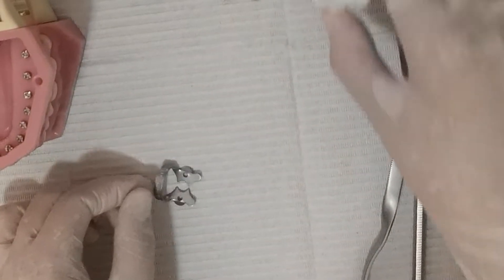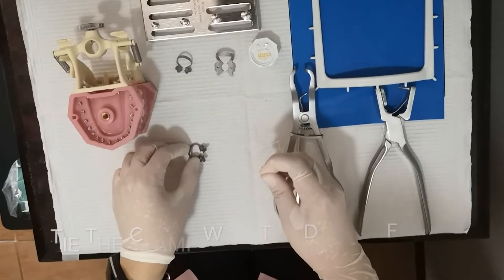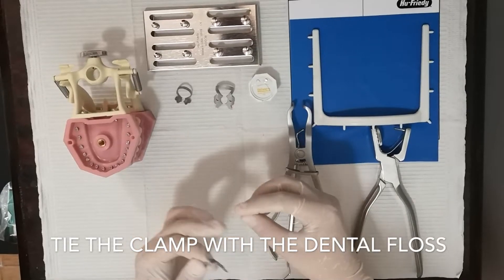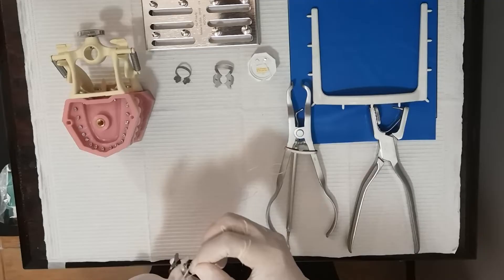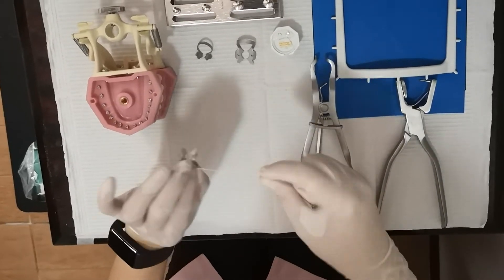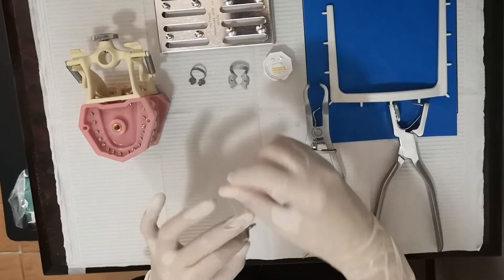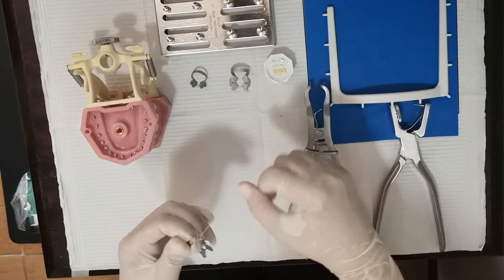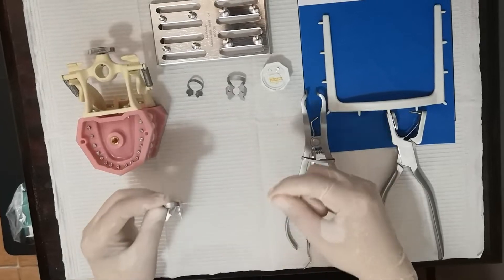We have to make sure that we put dental floss to secure the clamp. Press and repeat this five times. Now you have secured your clamp with the dental floss.